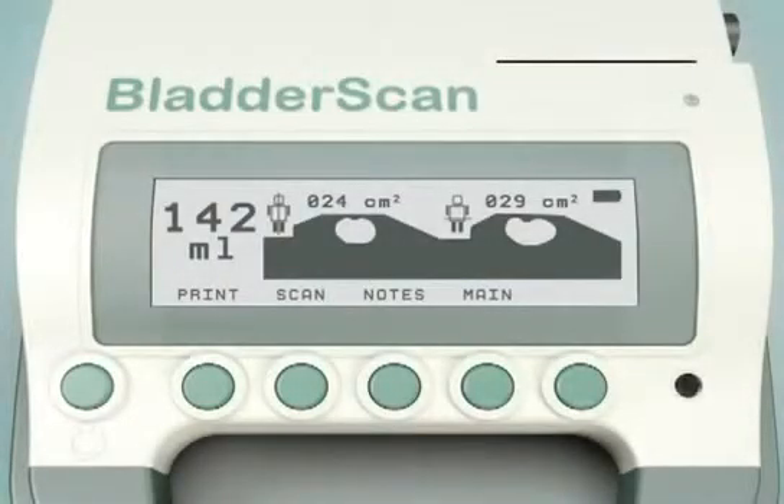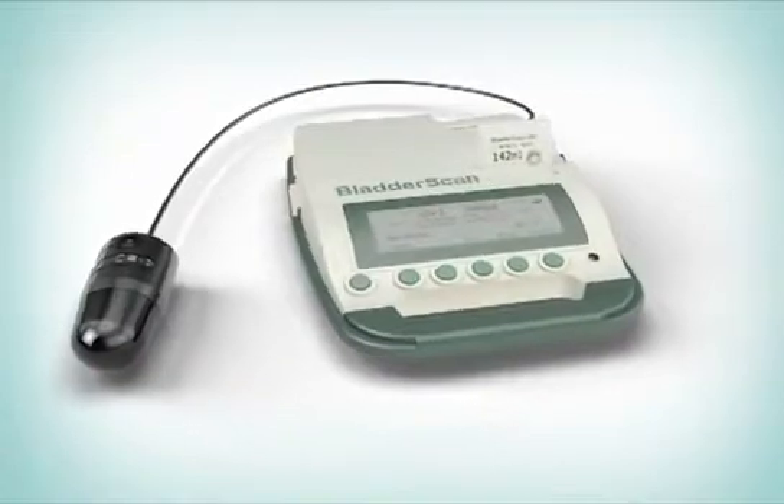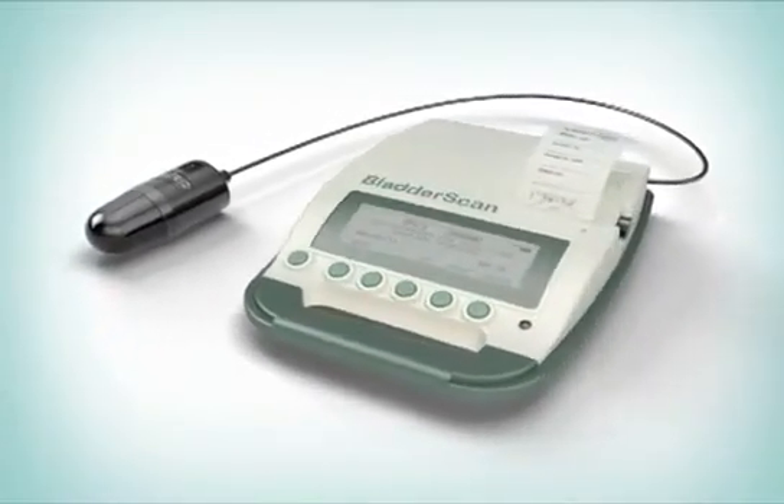When you have achieved an accurate measurement, press the Print button twice to print the exam result. It's that simple. The BladderScan BVI3000 gives you the information you need — quickly, accurately, and non-invasively.